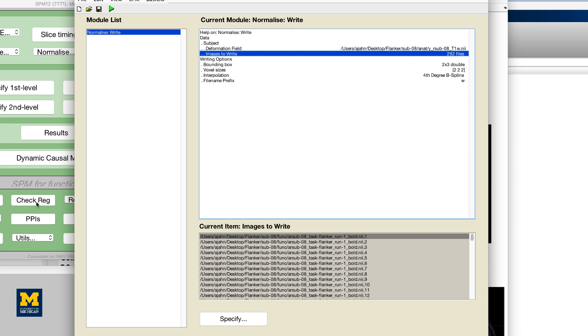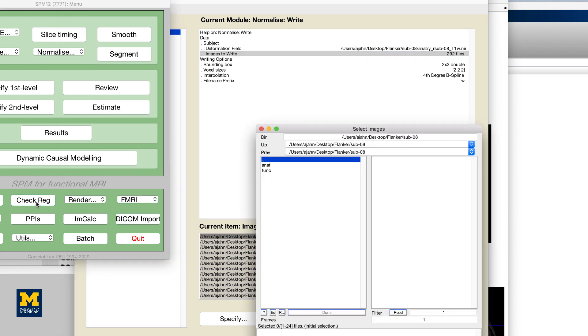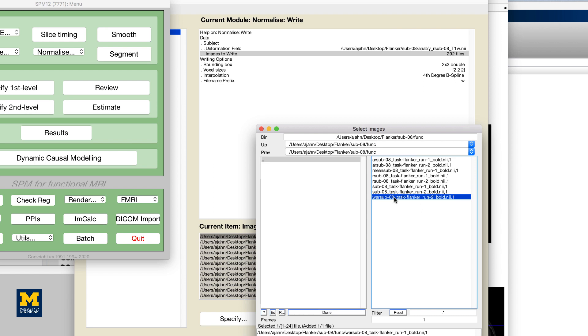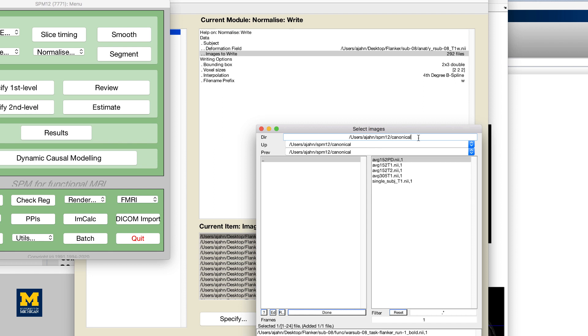From the SPM GUI, click on check reg and select one of your functional volumes that has a W prepended to it, indicating that it has been warped or normalized. For the second image, go to the directory SPM12 slash canonical and select any of the T1 images, either average 152 T1, average 305 T1, or single subject T1.